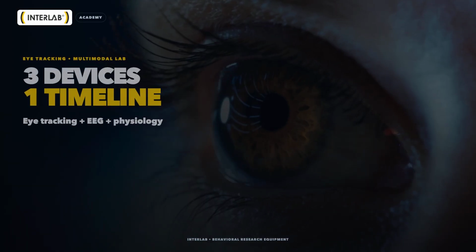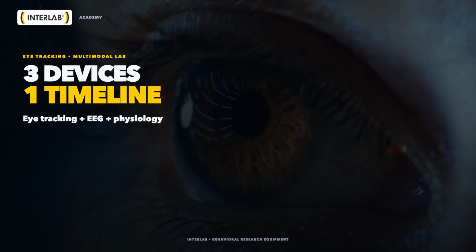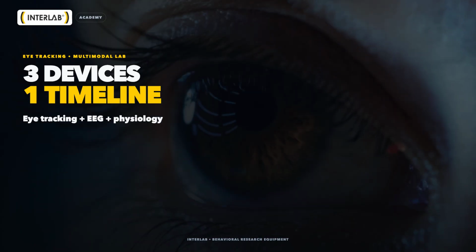An eye tracker shows where a participant looks. EEG records the electrical activity of the brain. Physiological sensors measure signals such as electrodermal activity, cardiac activity, and respiration. Each measurement can be valuable on its own.